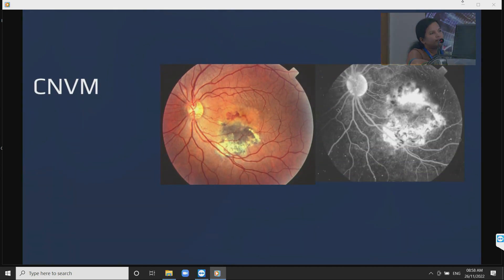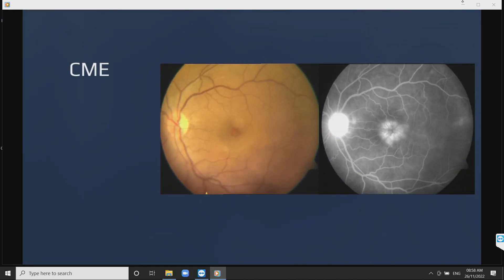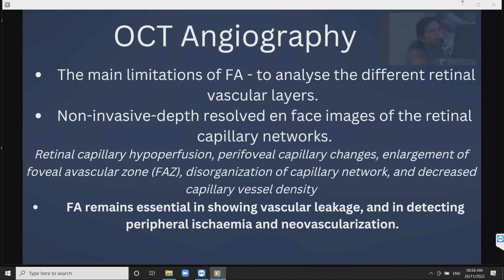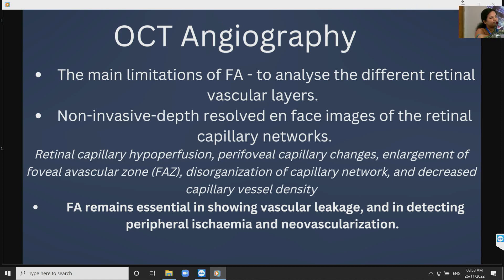FFA helps in detecting early complications like CNVM, which may sometimes be mistaken as a reactivation of an old scar. It also helps in detecting CME associated with chronic intermediate or posterior uveitis. A word about OCT angiography — it is a non-invasive, depth-resolved, fast imaging of retinal capillary networks. FFA is still essential for detecting vascular leakage and peripheral ischemia and neovascularization.